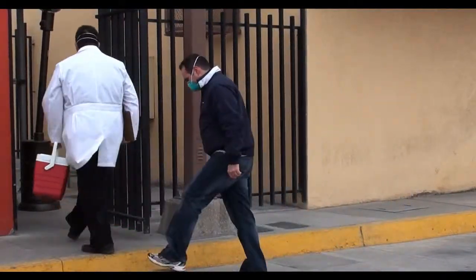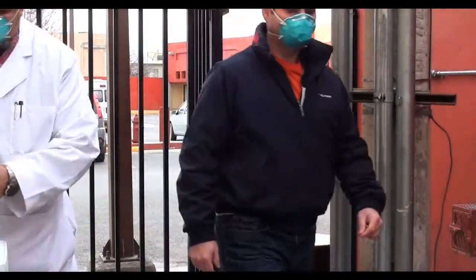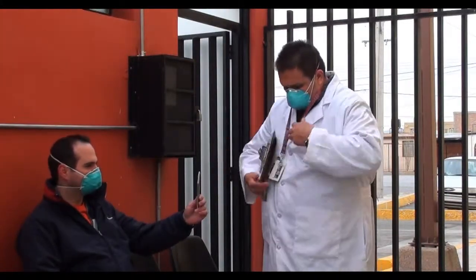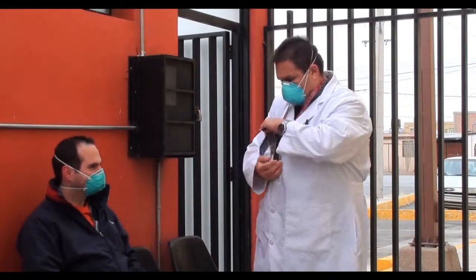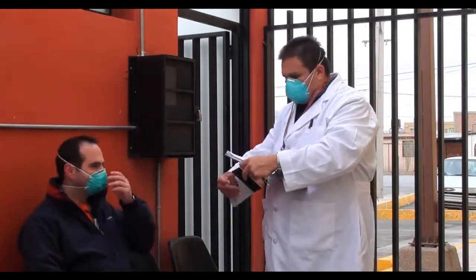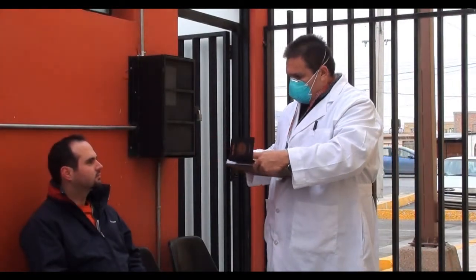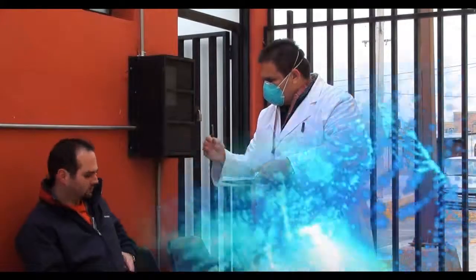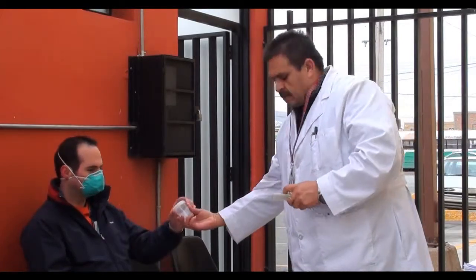Trained personnel goes to the designated area with the applicants that meet the criteria for the tuberculosis test, wearing an N95 mask at all times. Staff identifies each of the applicants through a valid passport. Also verifies that the applicants' names match the printed label on the sterile container where the sputum will be collected, and explains the procedure and technique that will be followed.